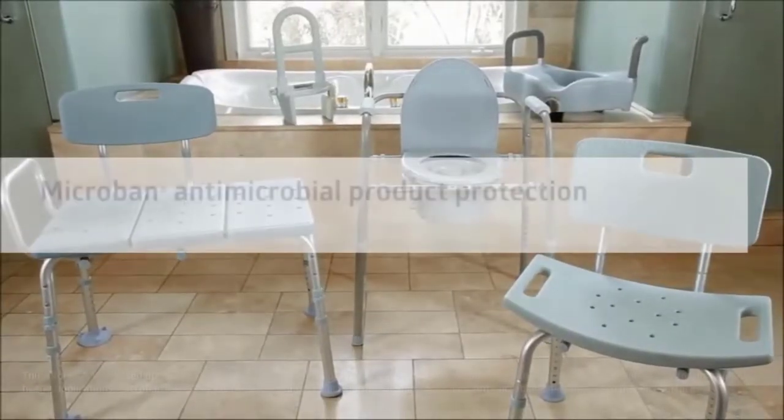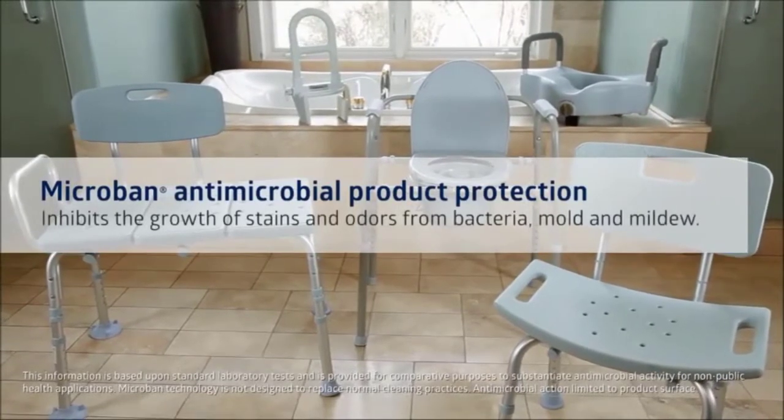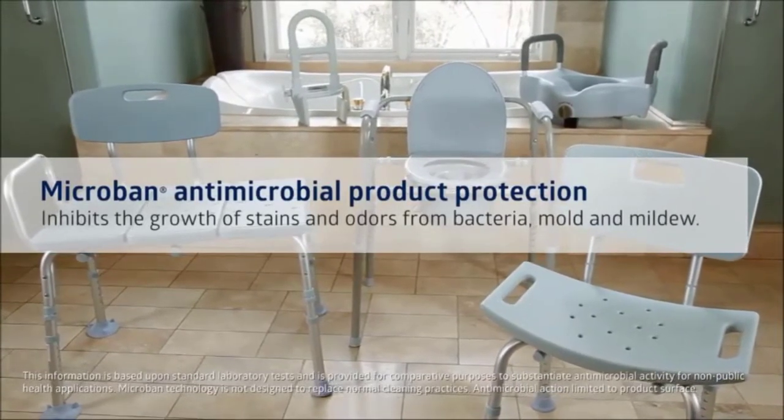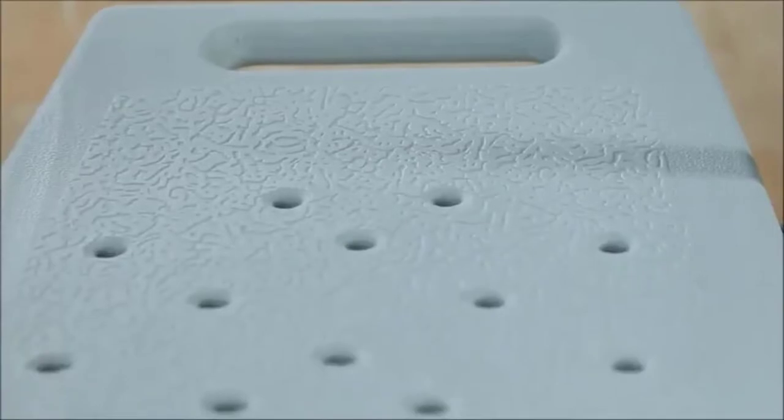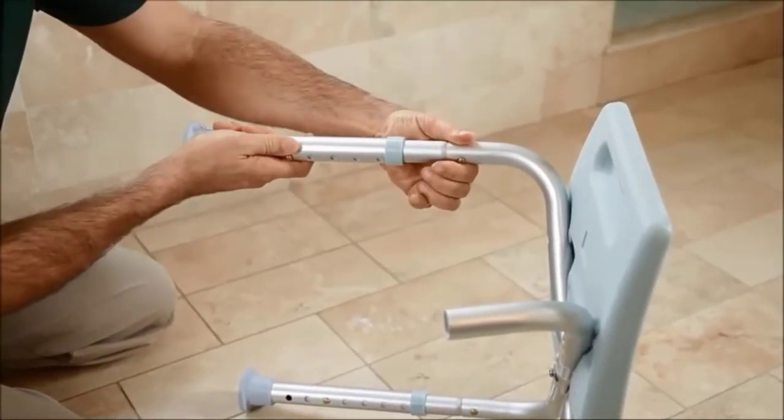Microban inhibits the growth of stains and odors from bacteria, mold and mildew, helping it stay cleaner longer, especially in moist environments. Since Microban is incorporated into the plastic during the manufacturing process, it never wears off. All products feature tool-free assembly and are light blue in color.